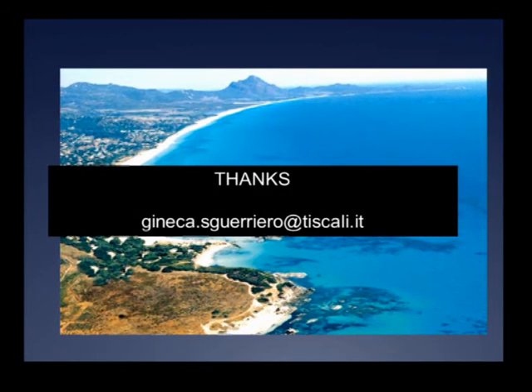Thank you, Stefano. Are there any questions? What I'm trying to get my head around, Stefano, is when you look at the performance of 3D ultrasound to predict nodules, how do you remove the fact that you've already done a two-dimensional scan before you do a 3D sweep? Recall bias, yes. We wait 6 months.